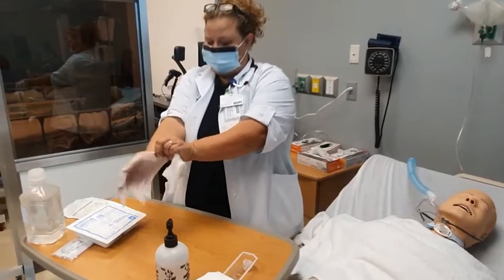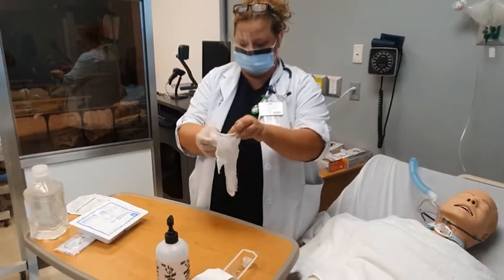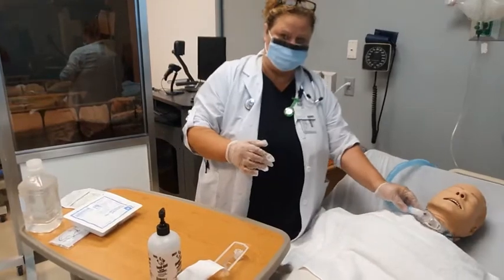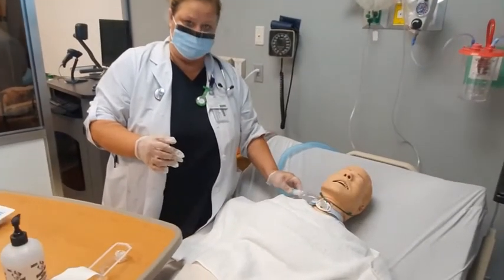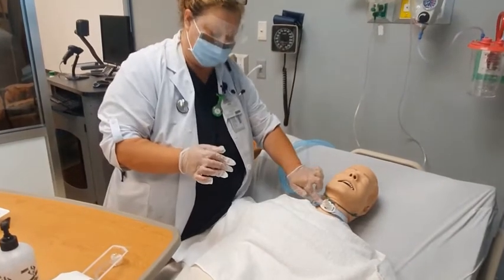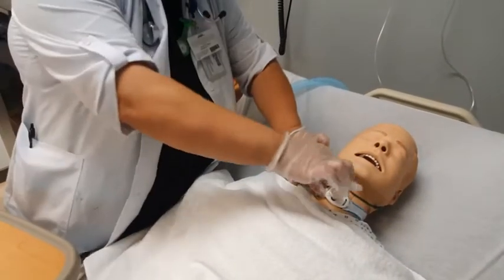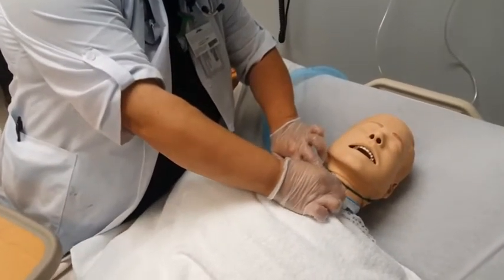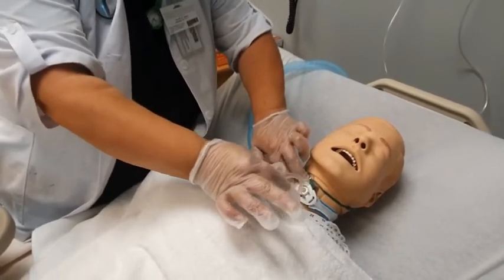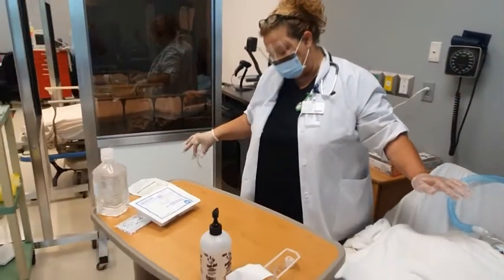When your non-sterile gloves are on, you can remove the oxygen source and detach the inner cannula. Remove and discard. So you're going to remove the oxygen source. You're going to take your left hand and gently touch this. The whole purpose of that is so when you're removing these little flanges and you pinch them and pull this out, you do not pull out the trach itself. And then you dispose of the cannula in the garbage.